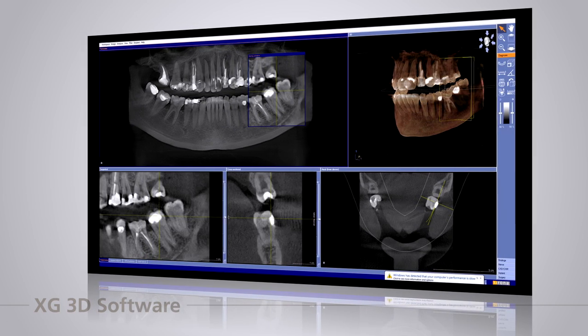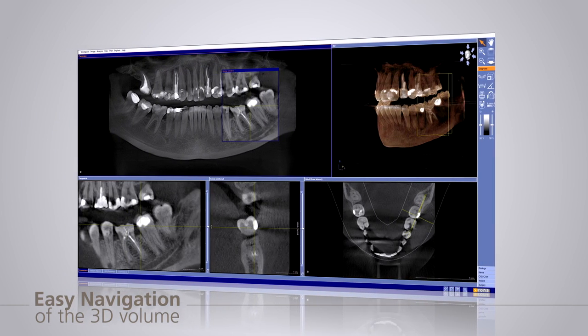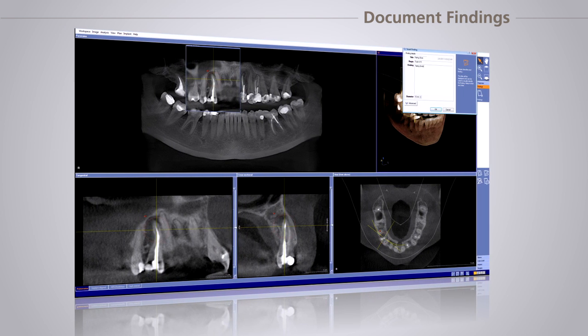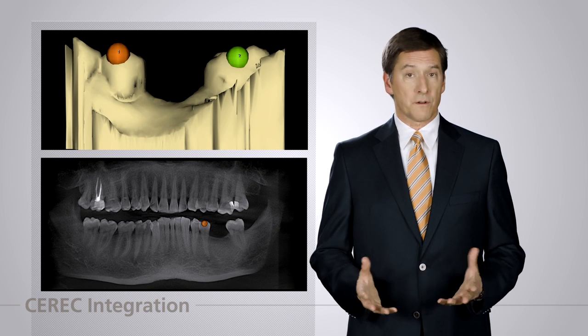A comprehensive software that flexibly accommodates your clinical workflow is the key to successful integration in your practice. With XG3D software you have the ability to scan, diagnose, plan virtual implants, integrate Sirona CAD/CAM, order surgical guides, and document your findings. Navigating the 3D volume using the patented slicing window makes diagnosis simple and efficient. With a reporting software option, you can quickly create custom reports that can be sent to referrals or saved in the patient's chart.